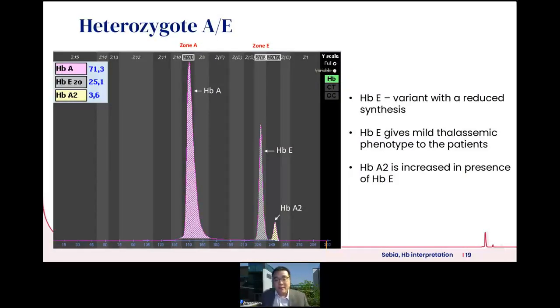Now, the heterozygous form of hemoglobin E, even though it's a beta variant, you will notice that the hemoglobin E fraction in this case is lower. It's about 25.1%. Uniquely, hemoglobin E is a special variant with reduced synthesis. So it presents like a mild thalassemia phenotype in patients because it affects hemoglobin E expression, unlike the other common variants shown in the previous slides that have a higher percentage in composition. Hemoglobin E is expectedly having a lower percentage, and hemoglobin A2 is increased in the presence of hemoglobin E. So note that it has a thalassemic presentation in a way.